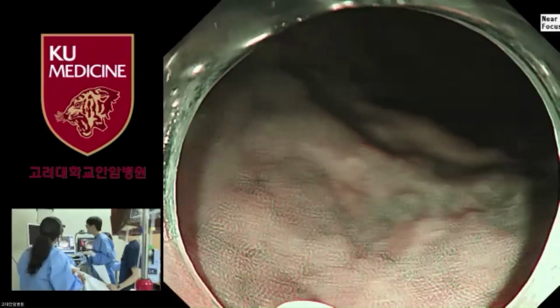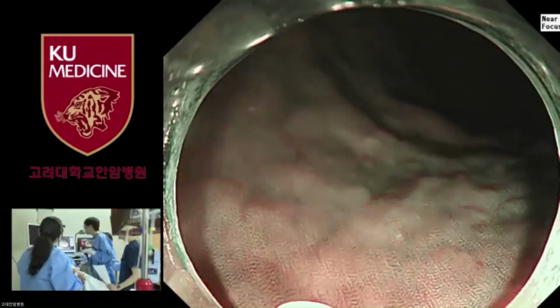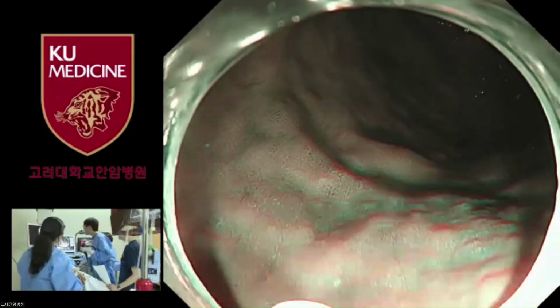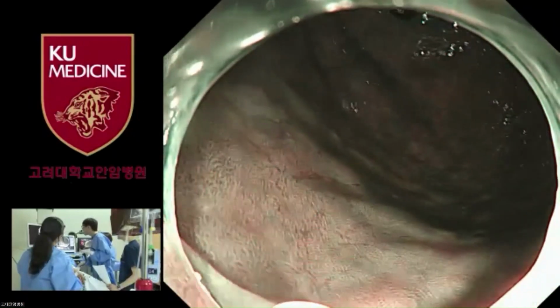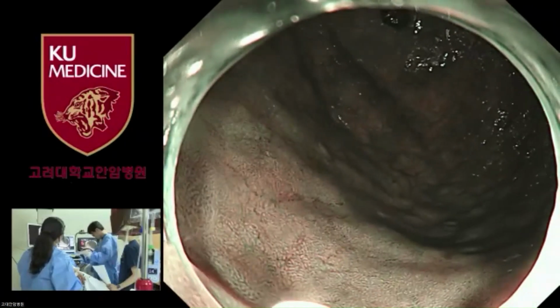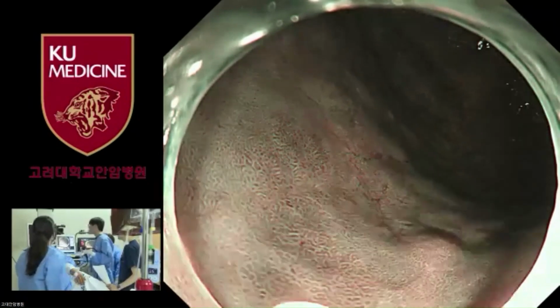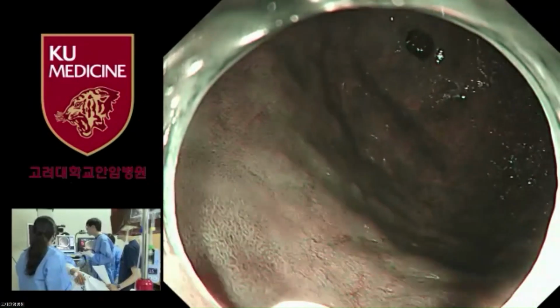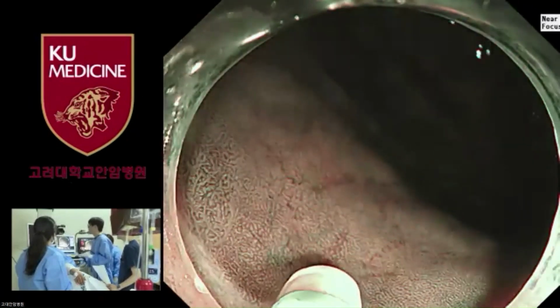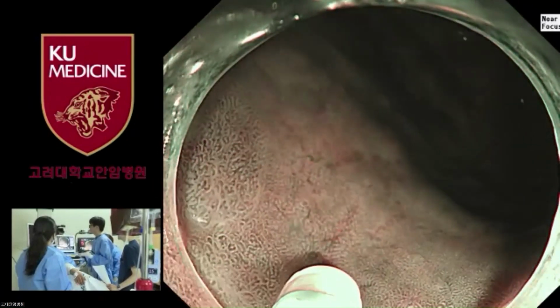The shape of the lesion is not round, it is a little bit irregular, with a patch-like mucosal shape. As you can see, the demarcation of the lesion is not that clear.